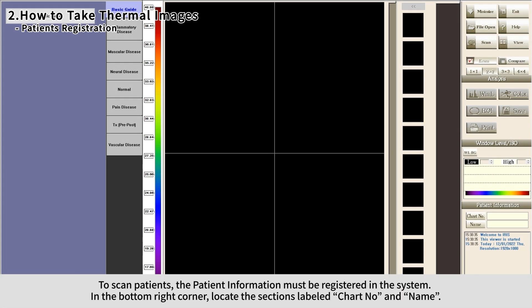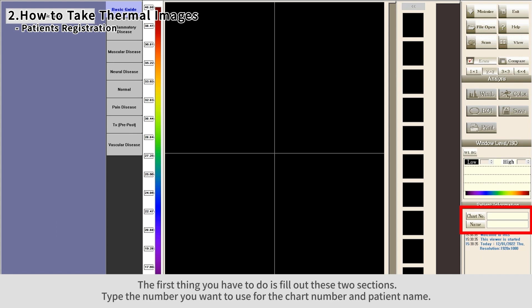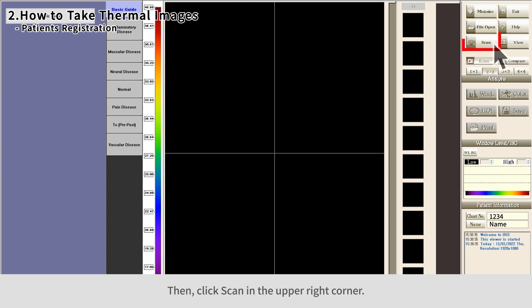To scan patients, the patient information must be registered in the system. In the bottom right corner, locate the sections labeled chart number and name. Fill out these two sections — type the number you want to use for the chart number and patient name, then click Scan in the upper right corner.